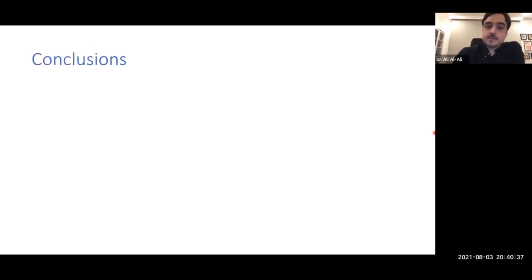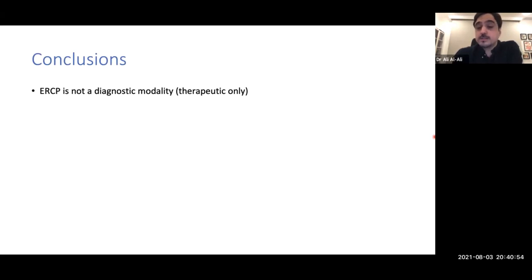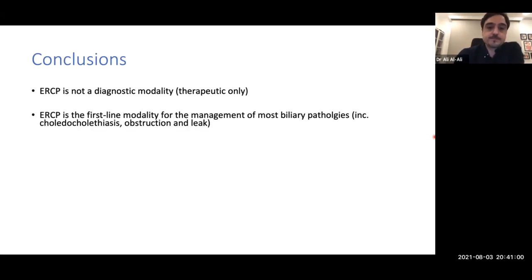So just to conclude, and this is honestly my most important message from today, ERCP should not be used as a diagnostic modality. It should not be used lightly. It should only be done therapeutically once we confirm a pathology by different imaging. And this is really to prevent the complications post-ERCP, which are quite common and can be quite serious.